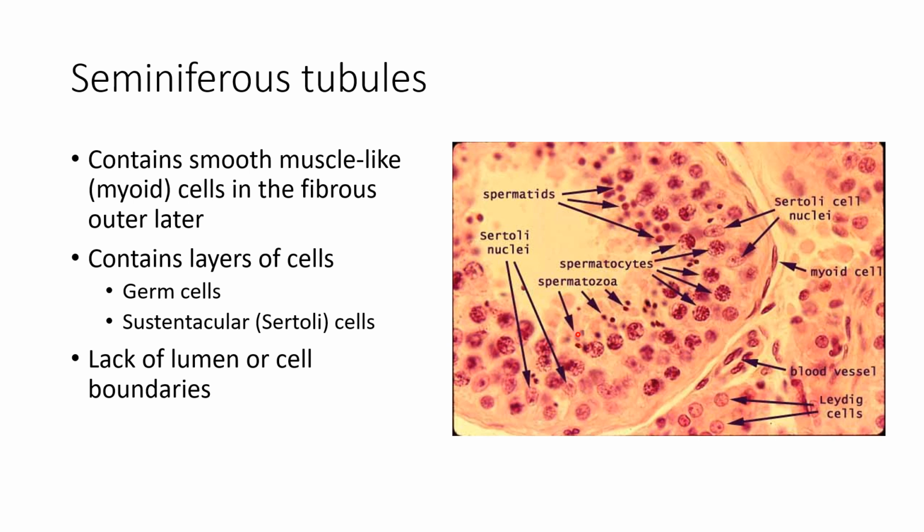Normally, different scientists have described about 6 layers you can find. Those 6 layers correspond to about 3 layers that contain the spermatogonium, one layer for the primary spermatocyte, another layer for the secondary spermatocyte, and then another layer for the spermatid.